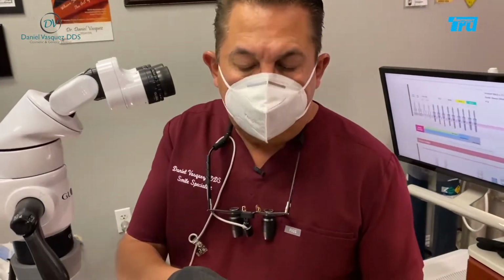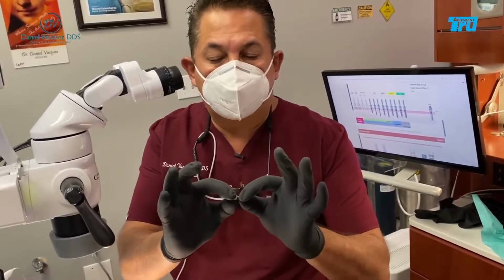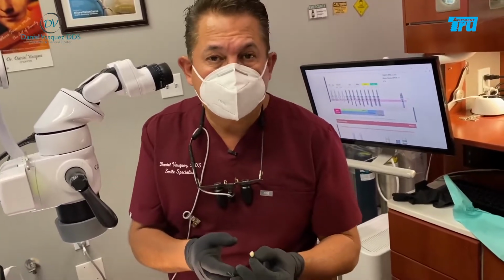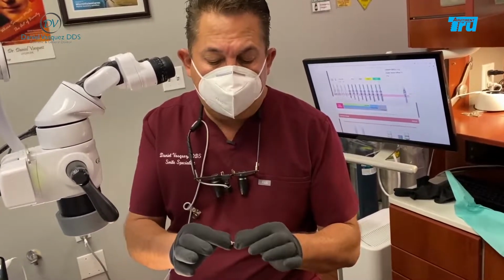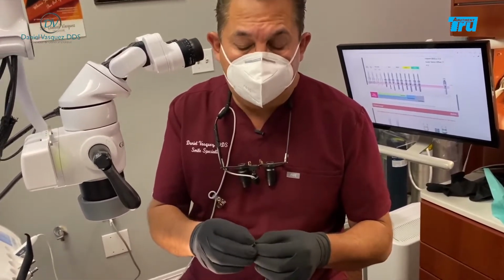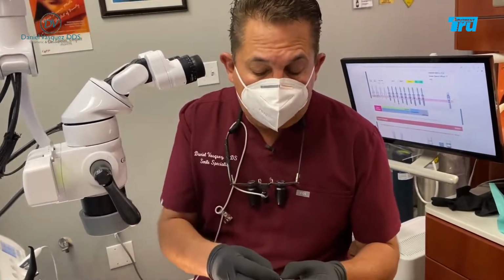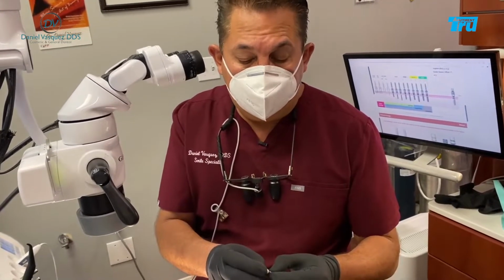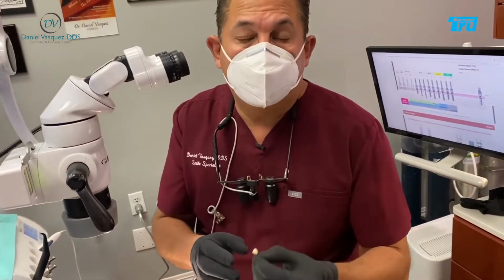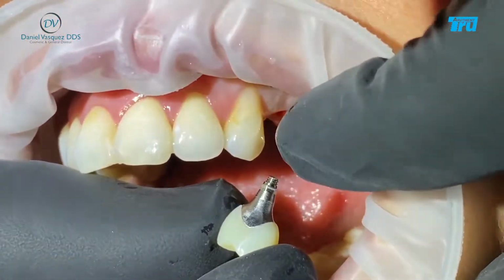So now, Priscilla, my dental assistant, already glued up, actually bonded both together. We only use a flowable composite. We just sealed the temporary to the abutment. We don't etch, we don't treat the inside of the metal. I'm saying we don't treat the abutment metal or the inside of the temporary crown. So we just want to seal because eventually we're going to be using the same abutment for our permanent crown. So this is together. Okay, beautiful.